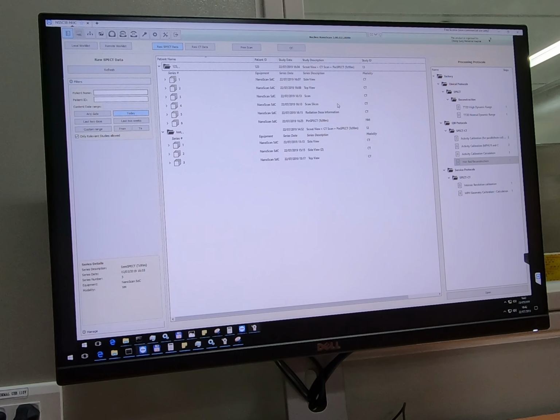So it is always applied for SPECT reconstruction because the system or the algorithm needs to know where the body is and where the air is in the field of view, because it has to consider the volume in the field of view where the scattering and the attenuating events happen with the photons before the detection. Okay, because we have to correct this effect.